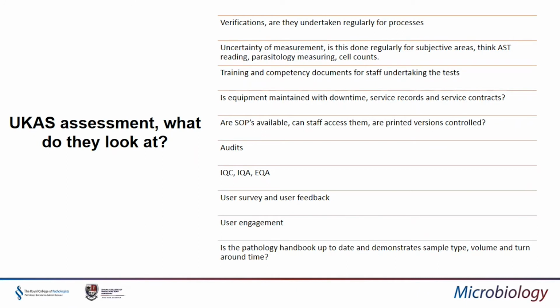So for us in Swansea, we need the containers with the boric acid in them, and anything that doesn't have boric acid in them will be rejected and won't be tested. So that is listed on the pathology portal. So our users can freely access that, and then anything that's not on there, they can contact us. Some of the specialist tests have a comment on there to say they need to contact us for more information, so we can discuss with them if they need anything.